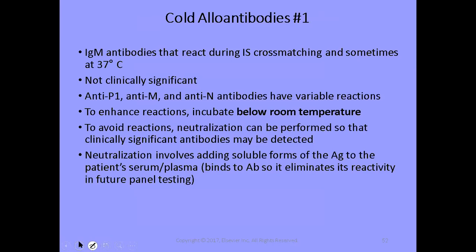Okay, so we're going to move on to a new topic, and we're going to move away from clinically significant warm reacting antibodies and talk a little bit about cold allo antibodies. Some of this we talked about when we were looking at the examples of antibody screen tests in the previous lecture.